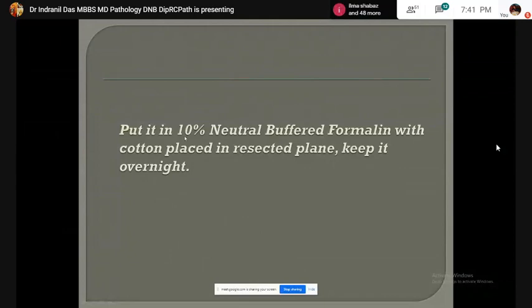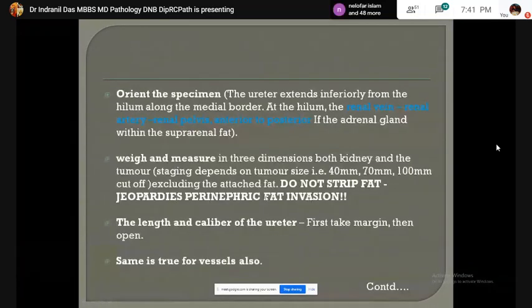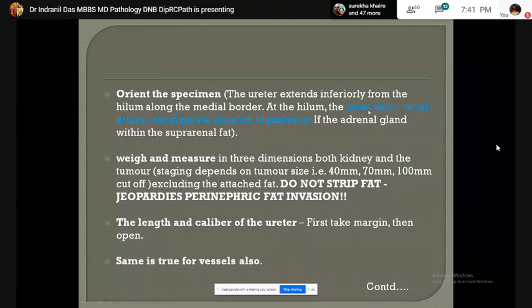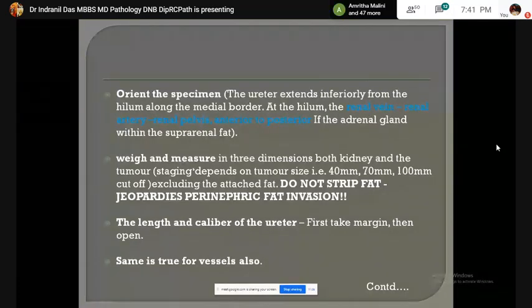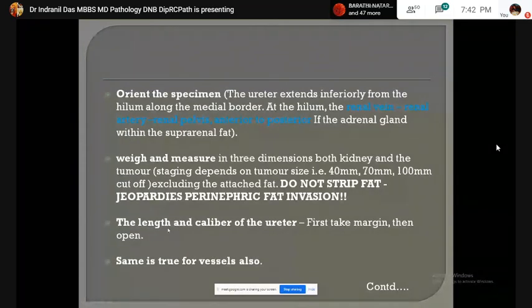The specimen is soaked in 10% neutral buffered formalin with cotton placed in the resected plane and kept overnight. On the next step, in the grossing room, the specimen is oriented first. The ureter extends inferiorly from the hilum at the medial border, and at the hilum, the renal vein and renal artery remain anterior to the ureter. Three-dimensional measurement of the entire specimen as well as that of the tumor is taken, and the tumor is weighed. The length and caliber of the ureter as well as vessels are noted.